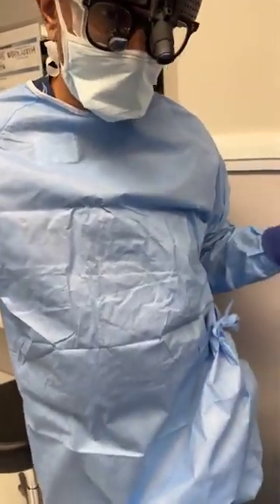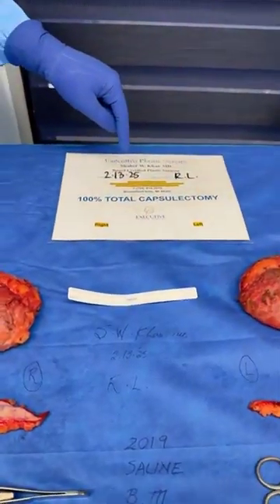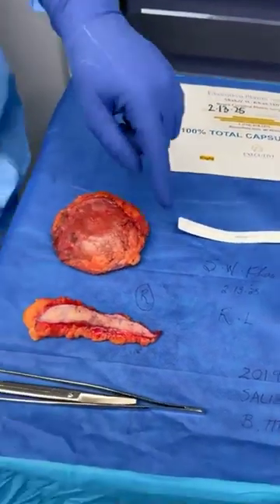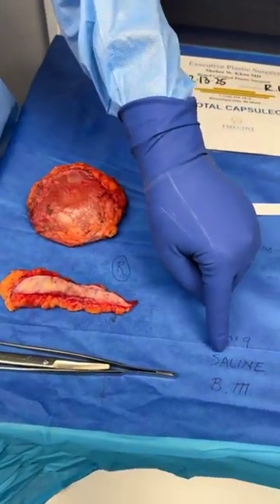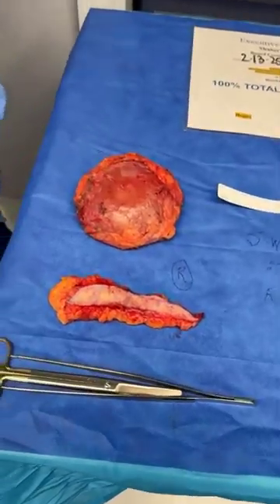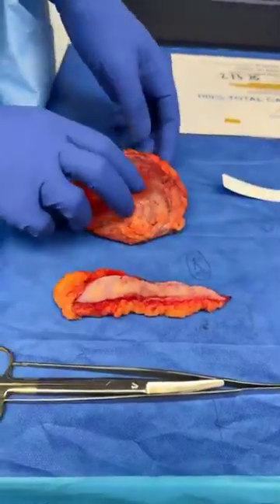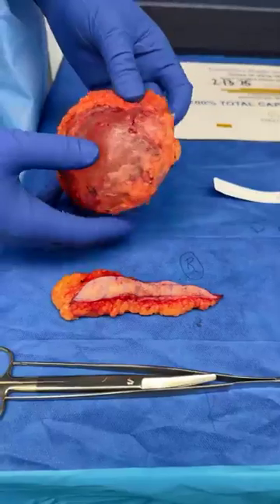So I've done what is a 100% total capsulectomy, initials RL, 2019 saline implants below the muscle. This is what the patient told me. And so I removed a lot of this tissue on the side to help with the contouring. I'm very happy with how the whole dissection has gone.